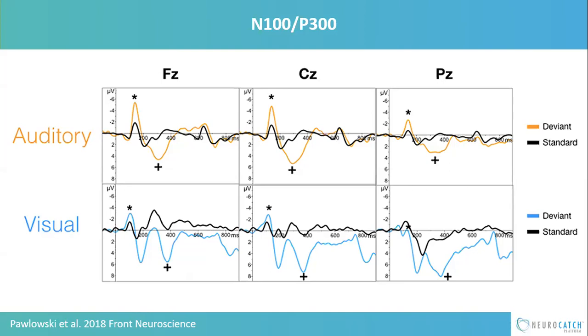And so the key thing here to recognize is this can actually also happen in individuals in the auditory modality. Some people might have two peaks, some have one. And the algorithm versus the trained eye, in its first version, was breaking down on this, and sometimes it would bounce between them. If it bounced between them, you can imagine you'd have very different latency and amplitude scores, particularly latency. So the next generation, and the team has a fix for this that actually catches this.